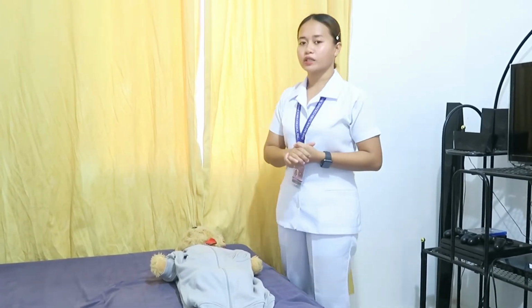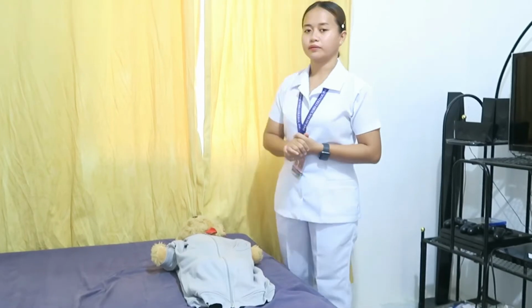After checking for the pulse and breathing, send someone to call for help and an AED to have the manpower and equipment to successfully resuscitate the patient. So, hey man in red shirt, please call 911. Next is the giving of high-quality compressions.